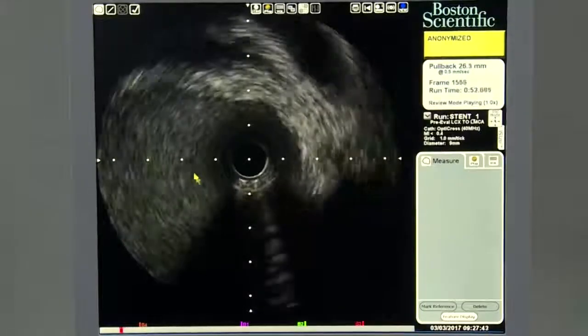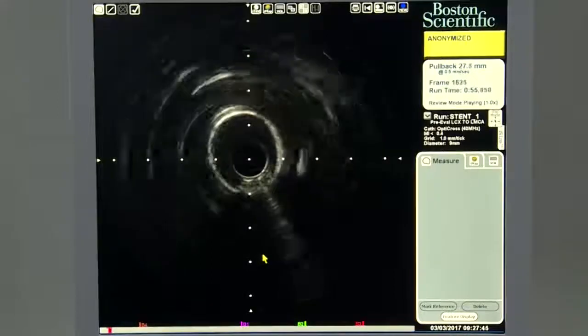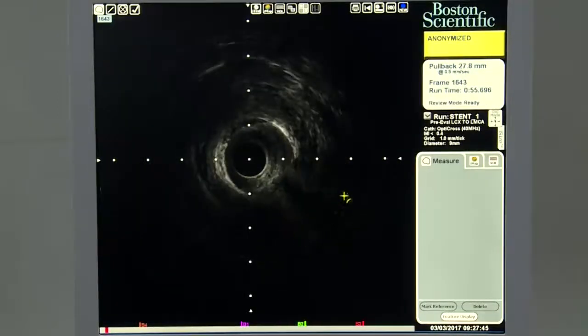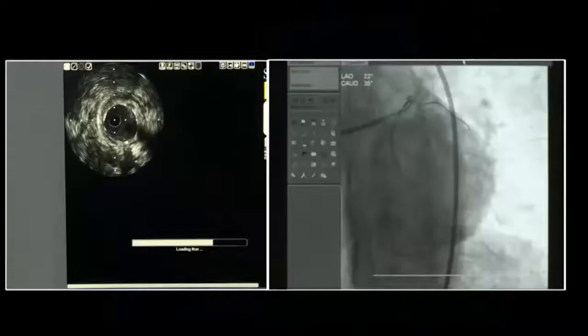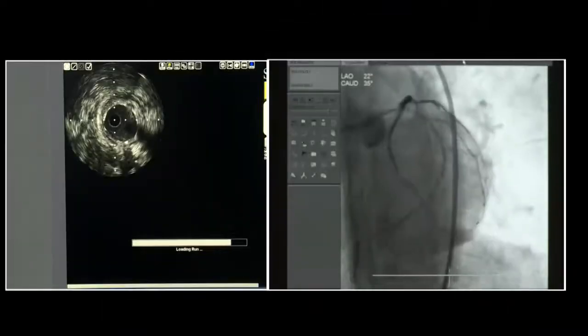This is a pullback going on, and there you get into the left main. So, may I have the opinion of the expert panel there? With that kind of atheroma, at least angiographically, which is not very clear, and IVUS shows there is an atheroma, which is, I was feeling actually in my mind, I think maybe 60% of the cross-sectional area.